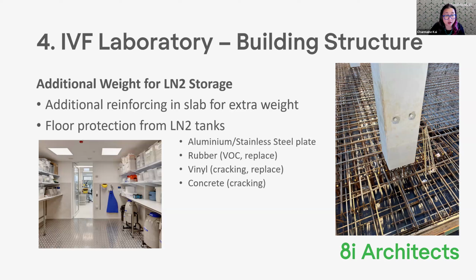A lot of times you might not have any control over the structure. That's generally the case. If you don't, the rule of thumb is that columns within your building are where most of the structure is. So if you can put your tank room near a column or very, very close to a column, ideally, you'll end up with more strength in those areas.